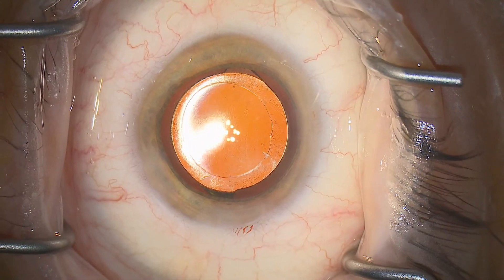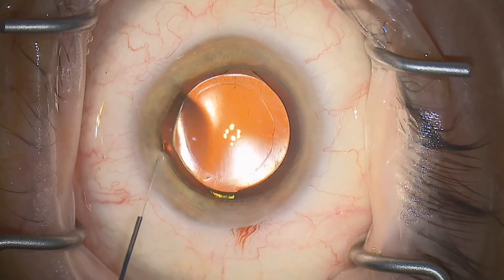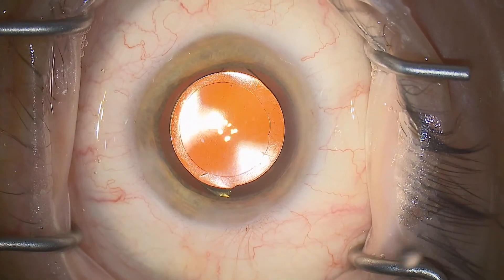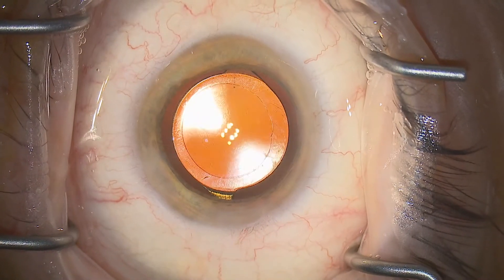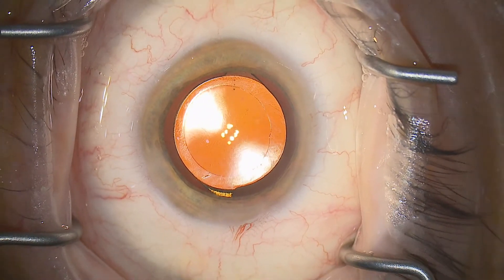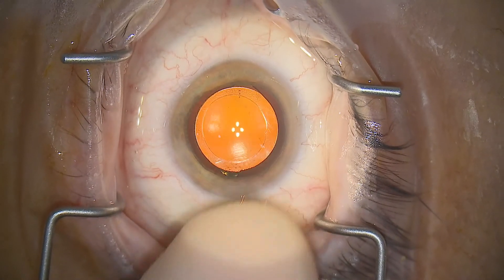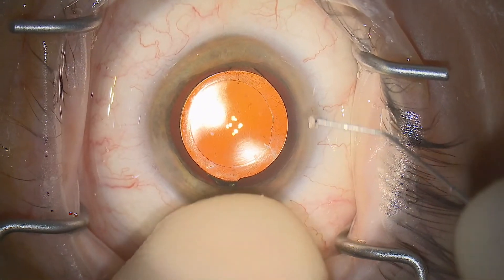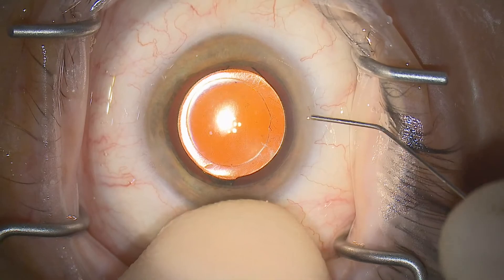Coming back with the intracameral antibiotics for final intraocular pressure regulation — just floating into the entry site to inject and fill the eye, checking the pressure is good with the index finger, waiting a few seconds to ensure pressure remains stable. If it's a little high, we advance a bit further into the paracentesis to allow controlled fluid egress, leaving the eye at a nice comfortable physiological pressure.